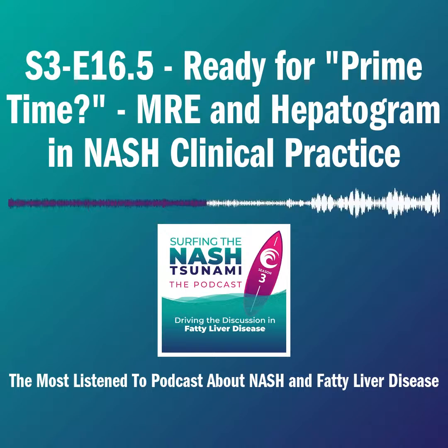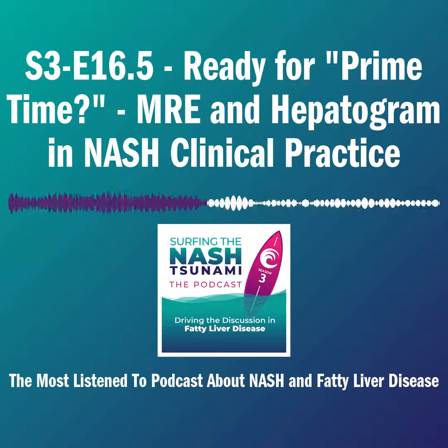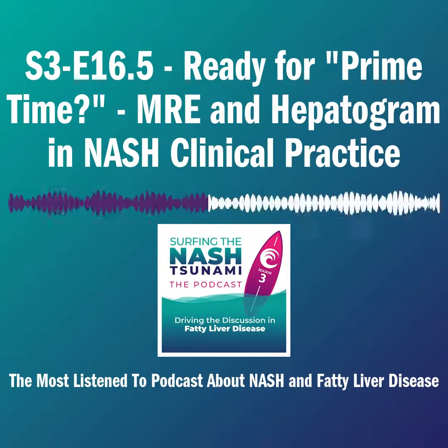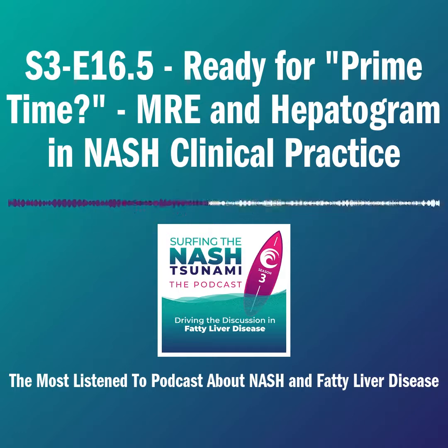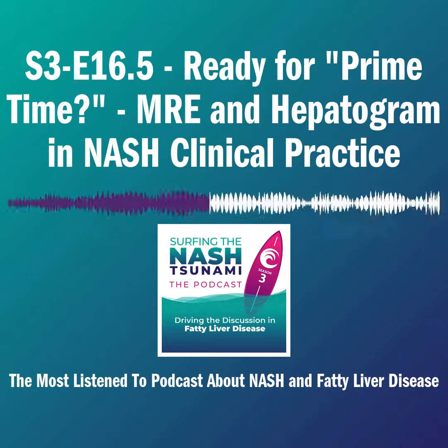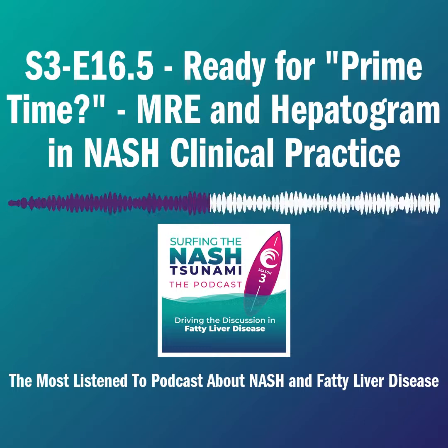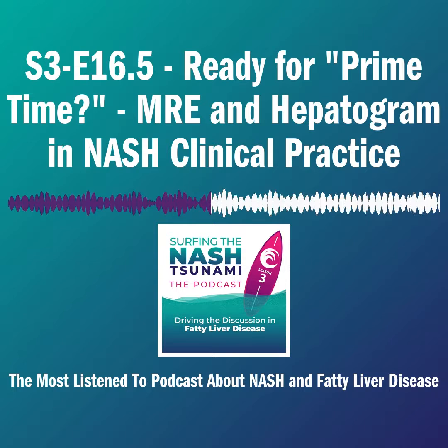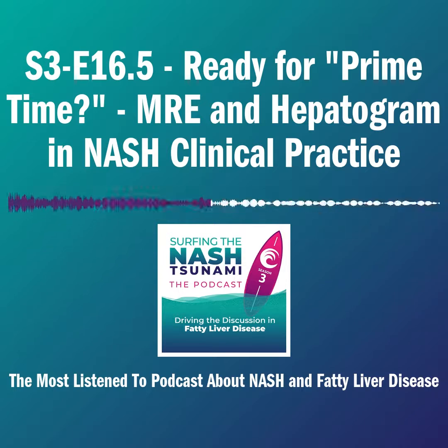Yeah, I think with anything, the FDA is driven by data. We are accumulating a large body of data with MR elastography, particularly as it pertains to the diagnosis of the at-risk NASH patient, those people that are likely to need pharmacotherapy to help them. And in parallel, we have drug development rapidly moving forward such that we potentially will have our first FDA-approved drug, if not this year, then next year. So in parallel with drug development, we have non-invasive testing development, and I think MRE has really taken a huge step forward here, particularly with that context of use of diagnosing the at-risk NASH patient.